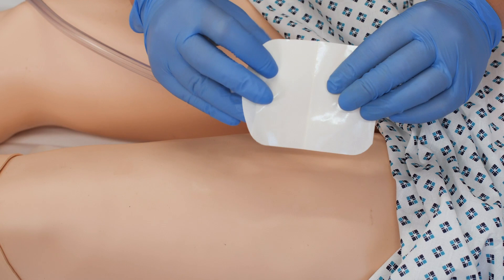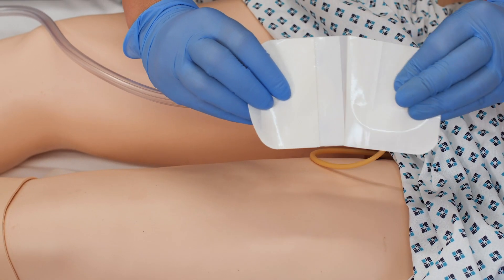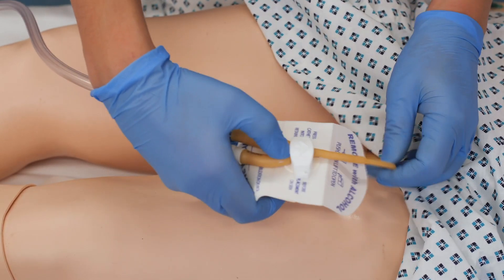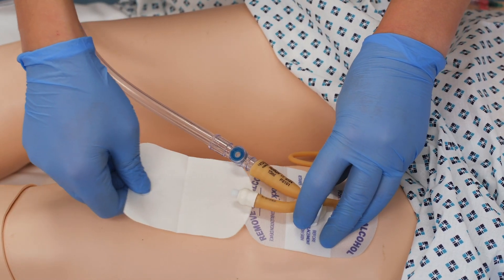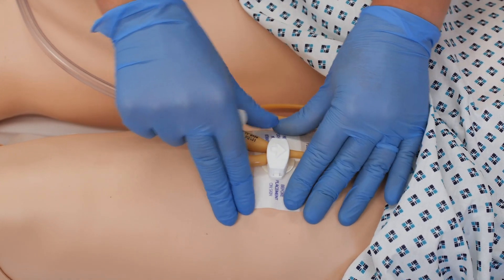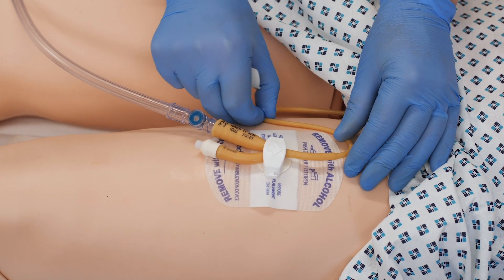It's essentially a piece of big sticky tape, so we peel them back. The key is to keep a kink in place - keep a kink of the catheter - so you haven't got any tug on the catheter that will cause damage to the urethra.